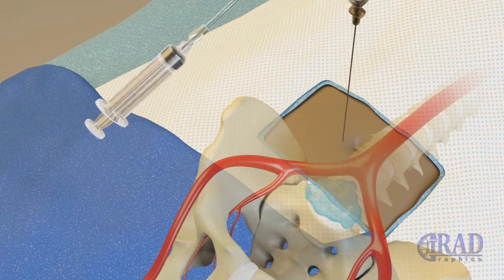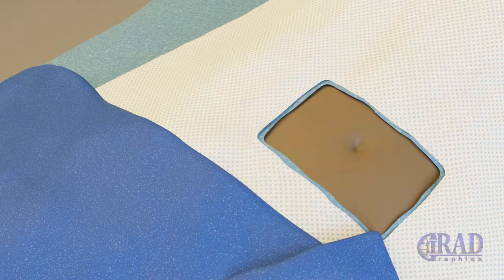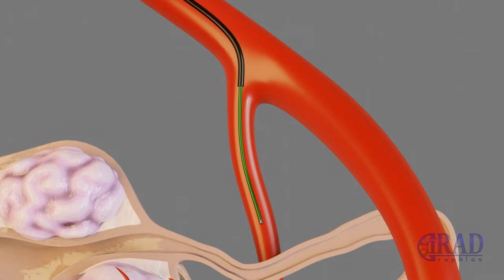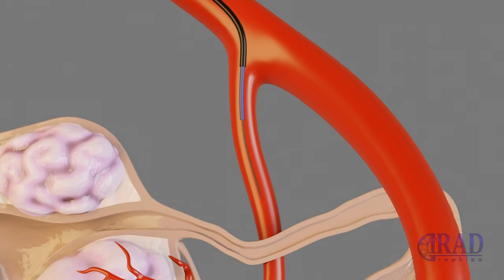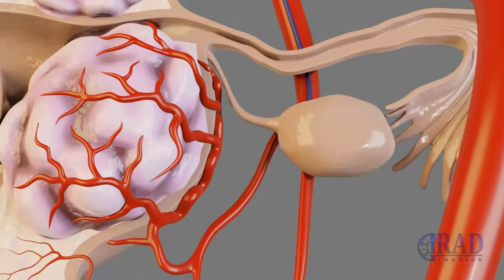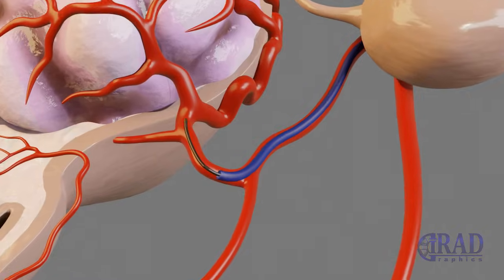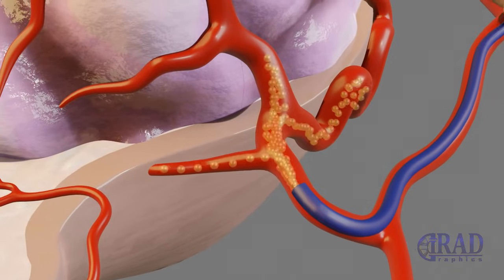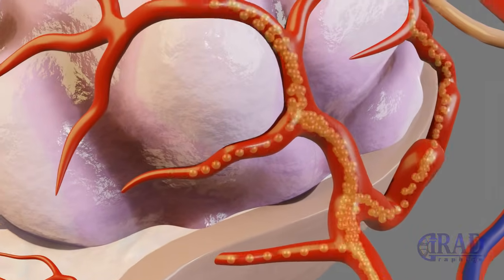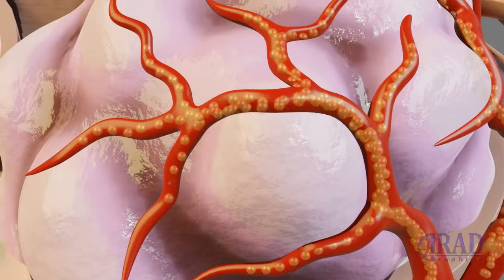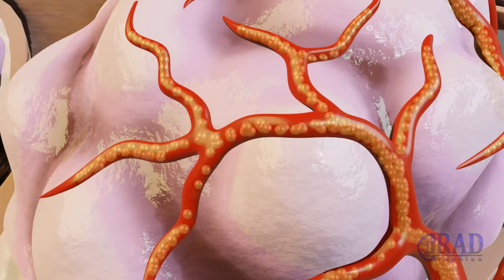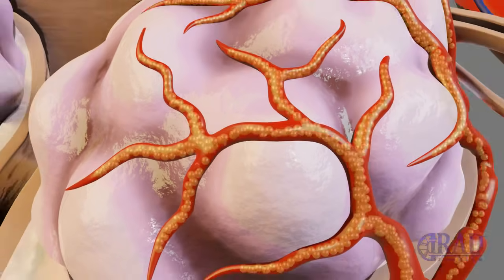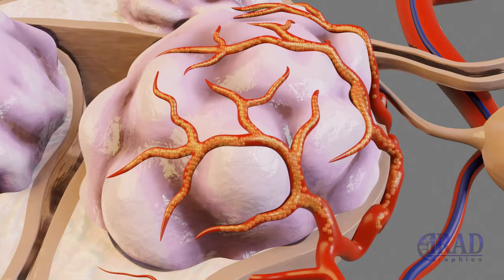After injecting the cocktail, the needle is removed. The wire is then exchanged for a combination of microcatheter and microwire, which is advanced to the uterine artery. Once the unwanted collaterals are bypassed, the uterine artery is embolized using particles until the blood flow slows down — in other words, stasis is achieved.